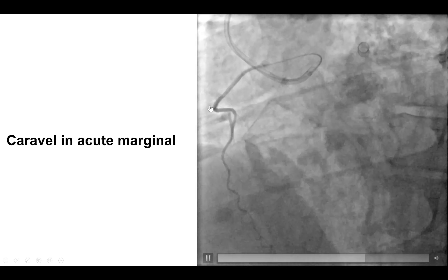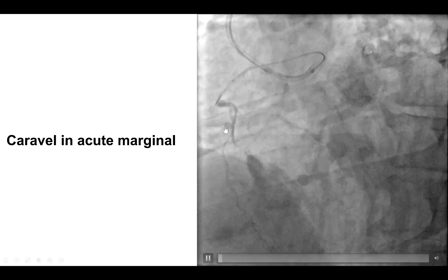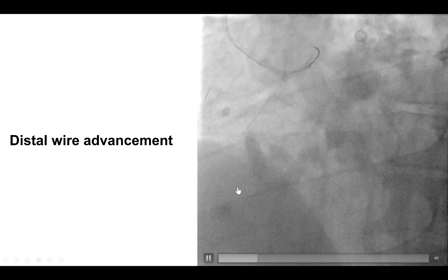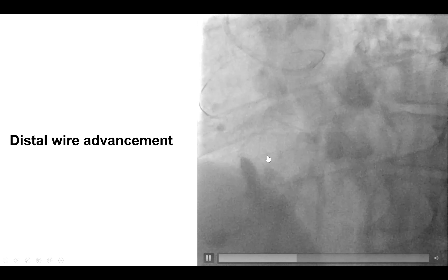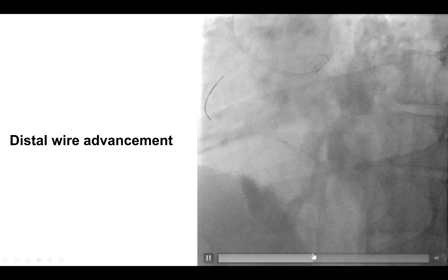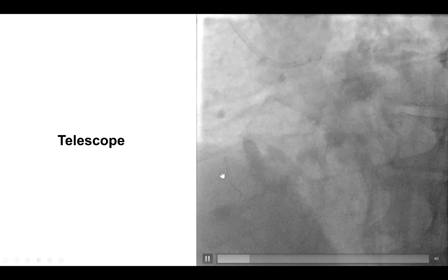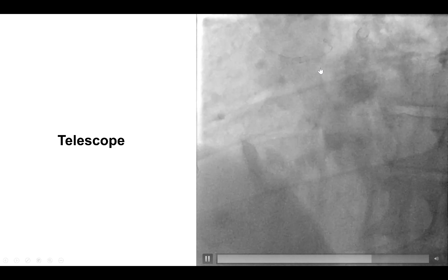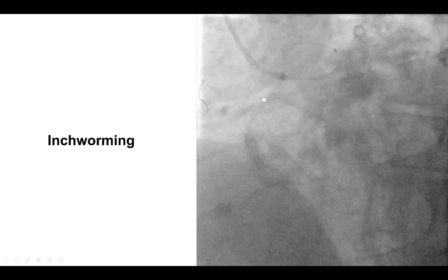The microcatheter was inserted and an injection was done. It turned out that the vessel we were in was not the right coronary artery, but a large acute marginal branch. Nevertheless, given the difficulties with hardware engagement, we advanced the wire further down in this branch, and then inserted a wiggle wire to help support the guide and assist with equipment manipulation. The next step was to use the guide extension to more selectively engage the vessel, and this was achieved using the Telescope guide extension.